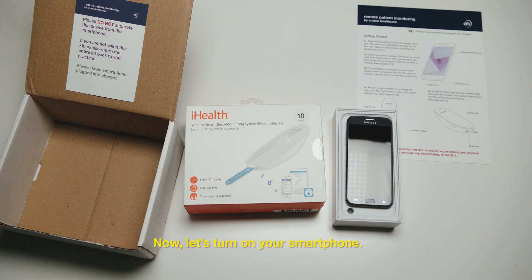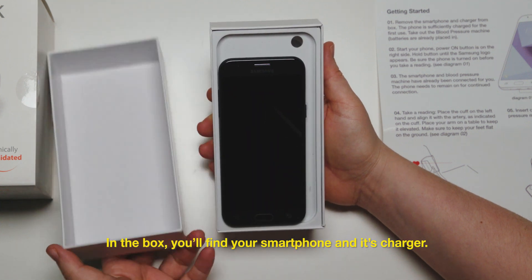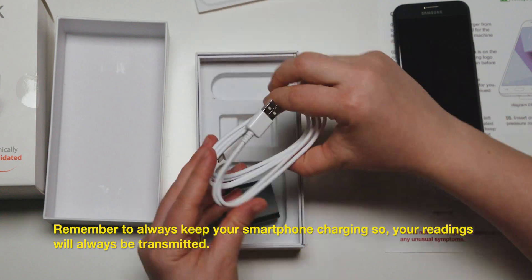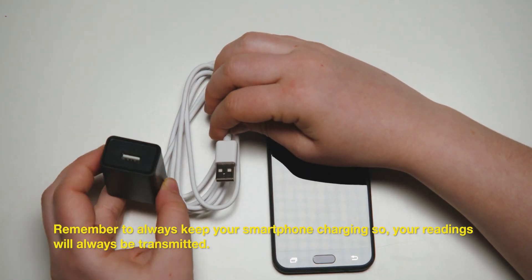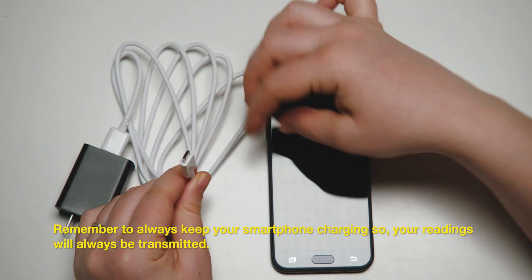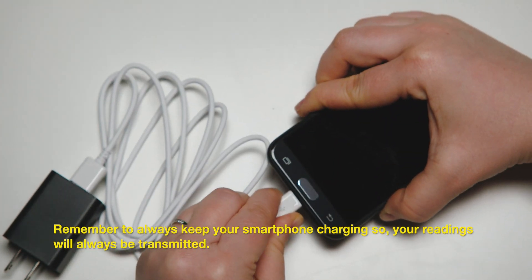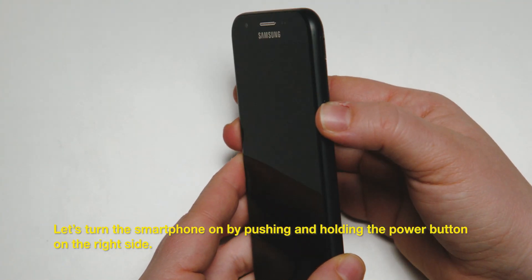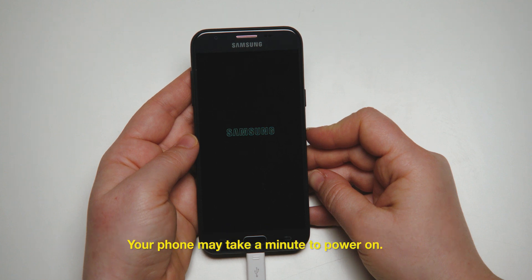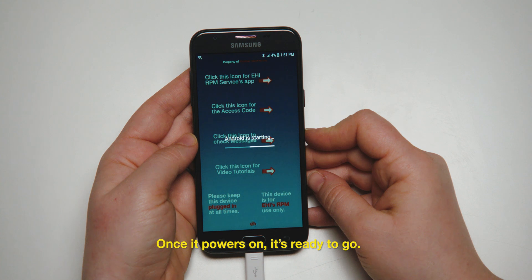Now let's turn on your smartphone. In the box, you'll find your smartphone and its charger. Remember to always keep your smartphone charging so your readings will always be transmitted. Let's turn the smartphone on by pushing and holding the power button on the right side. Your phone may take a minute to power on. Once it powers on, it's ready to go.